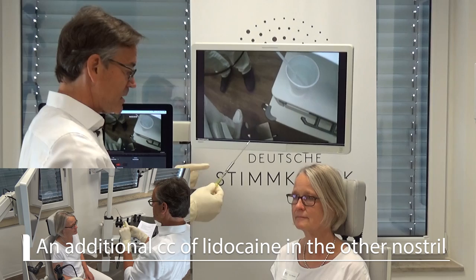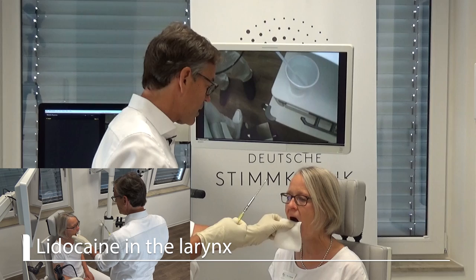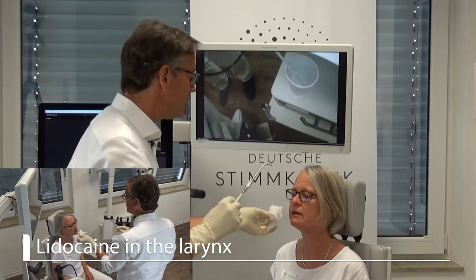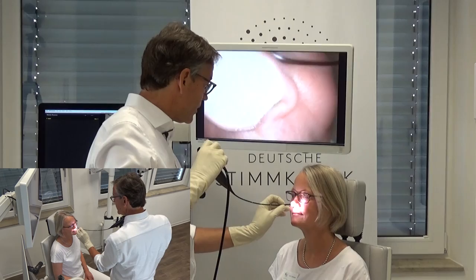After that I also want to put some of the lidocaine into the larynx, and that's why I'm using a gauze square and ask her to stick out her tongue all the way — up — and then while she's saying for a couple of seconds. Now she will do a laryngeal gargle so that she has enough numbing of the nose and the pharynx.